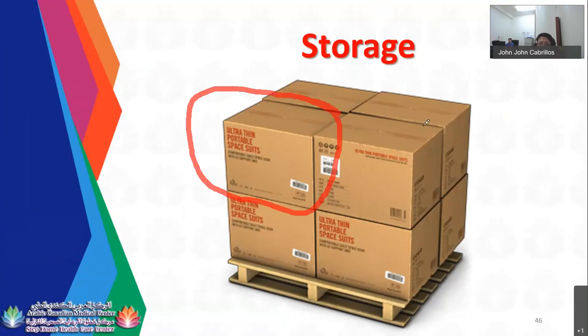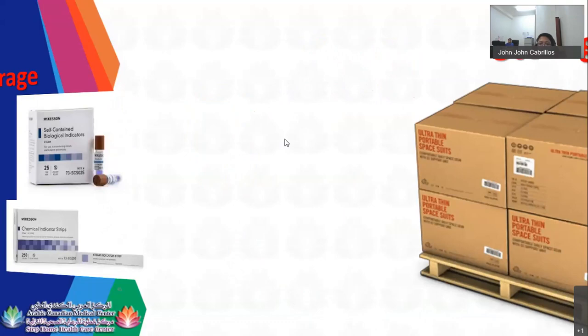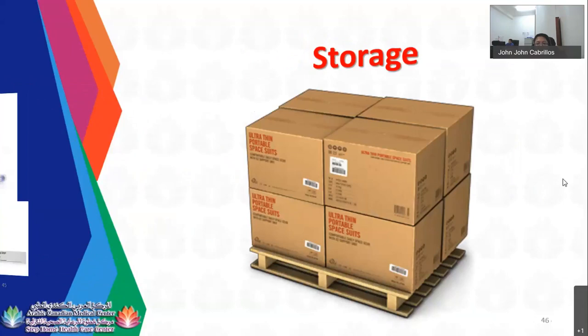You can store whatever inside the container, whatever consumables inside, whether original boxes, you can store them. But for logistic box, you cannot store them because the logistic box is considered contaminated and dirty. So this is considered dirty due to transportation and handling issue. So logistic boxes shouldn't be stored in CSSD. So for this one, for example, this is the contents of your logistic box, then you can store it.